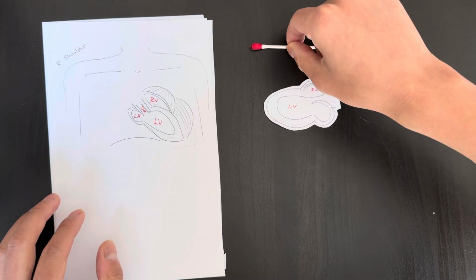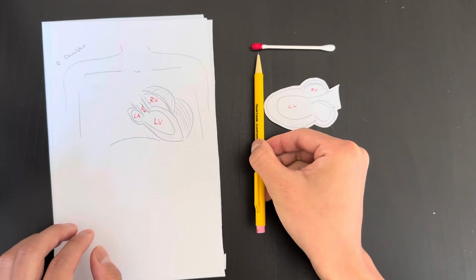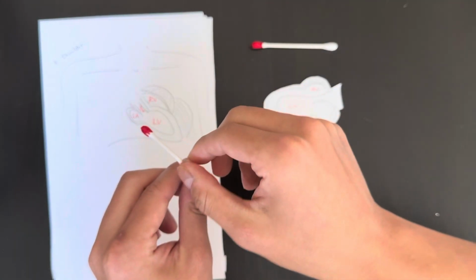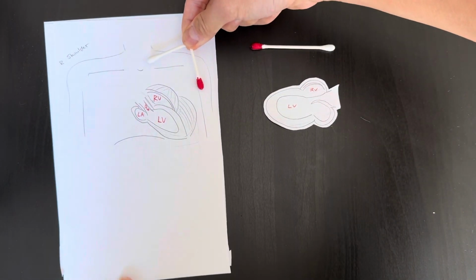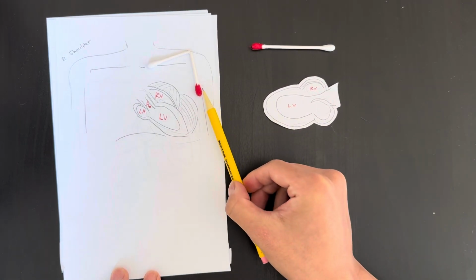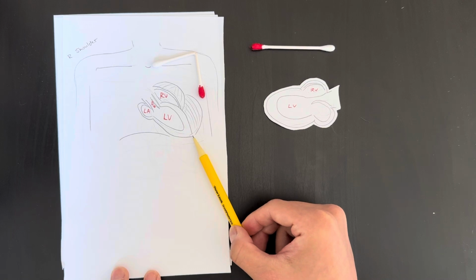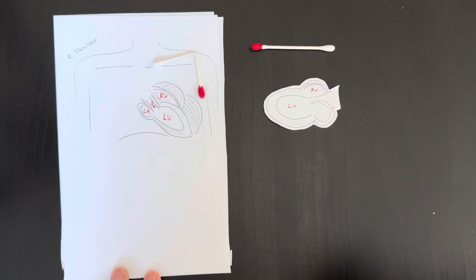If I was in a traditional radiology mode, my probe marker would be pointed towards my left, which in this case is actually pointing towards the LV of the patient. All right, so it's my left, but also the patient's left, okay? So typically I'm cutting it diagonally. I'm using my probe marker, I'm cutting it diagonally like this. But for our purposes, I'll show it to you this way. If I was pointing to the LV, or the left side of the patient, I surprisingly have my probe marker this way in a traditional radiology mode. So probe marker to the patient's left, pointing towards the apex of the heart. This is how you get a parasternal long. And again, I'm coming at an angle, and so even though my heart's rotated, it comes out on the screen like this, or it should.